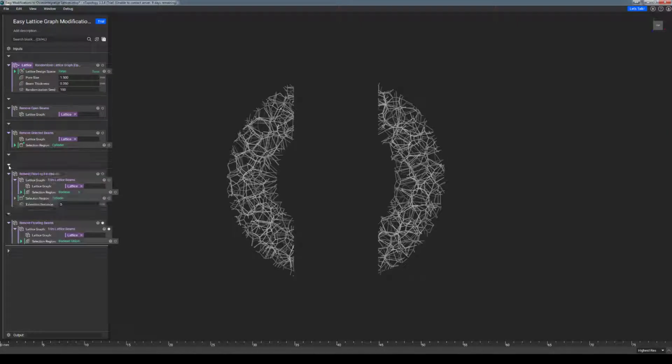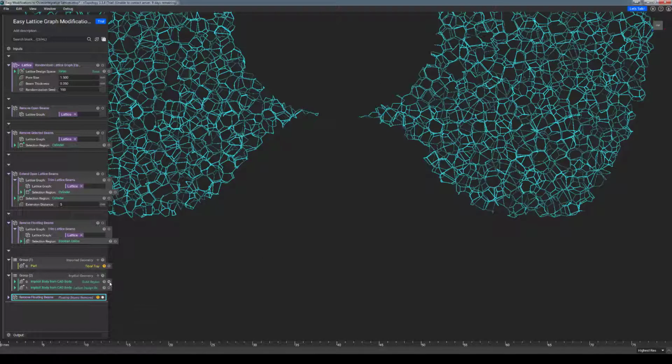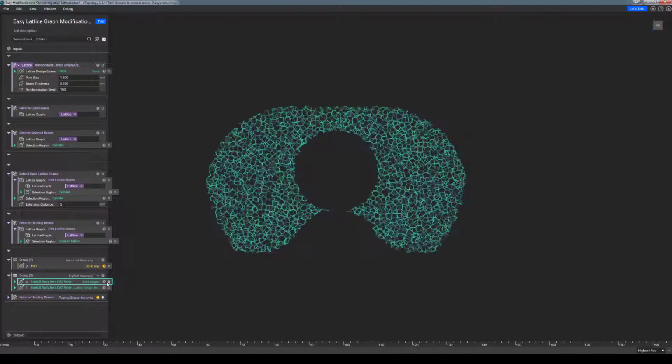As always, any of these custom blocks can be opened up and explored so that a stronger understanding of what is happening can be attained. Perhaps with this knowledge and baseline functionality, an even more unique solution can be developed specifically for your design and your organization. From design to output, nTopology offers not just a variety of ways to control aspects of your osseointegrative lattice design process, but also a variety of ways to control where and how that design process can be applied.